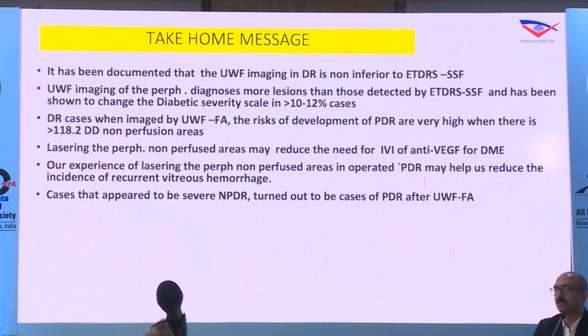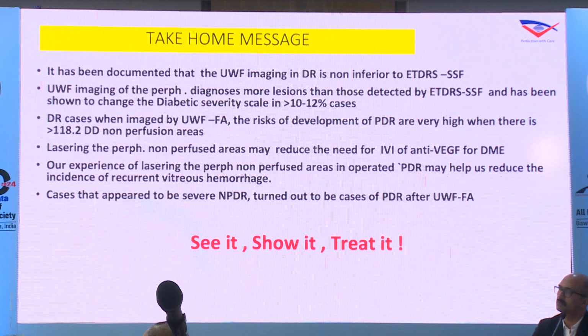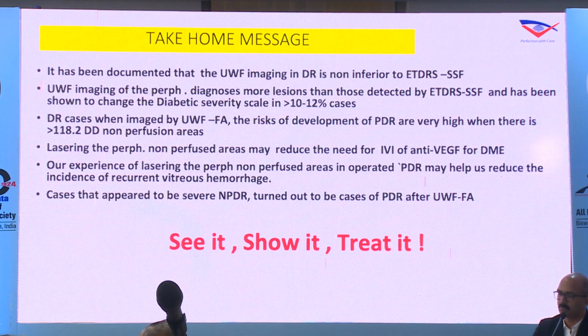We have been able to treat patients who were having recurrent vitreous hemorrhage. Since I bought the machine, my incidence of recurrent vitreous hemorrhage in these sort of patients has certainly reduced. So this machine can allow us to see it, show it to the patient, and treat it adequately.